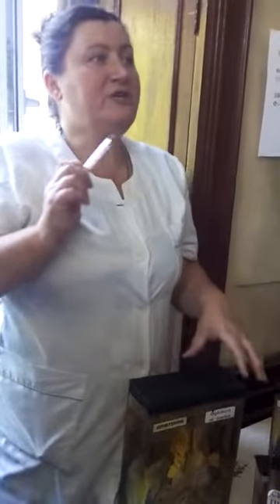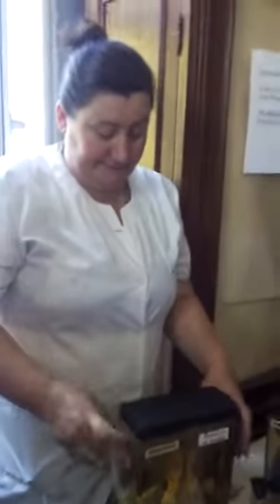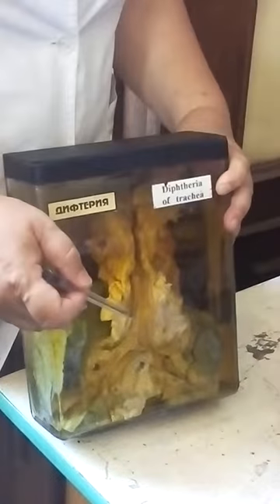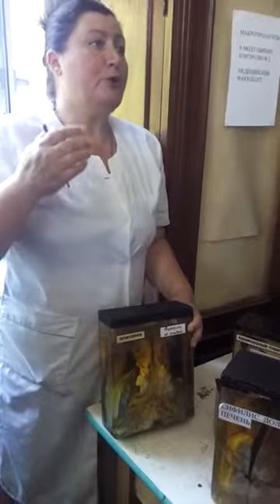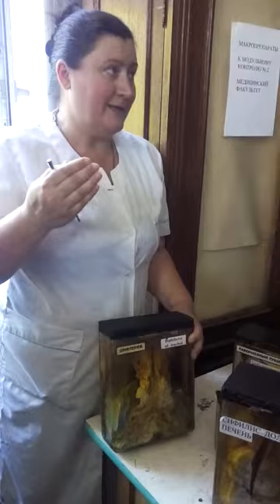Is it? So, here we need to say it doesn't there. No presence of these free films lying in the lumen. Why? Because different kinds of fibrinous inflammation. There are two, croupous one and diphtheretic one. Croupous on the simple epithelium.